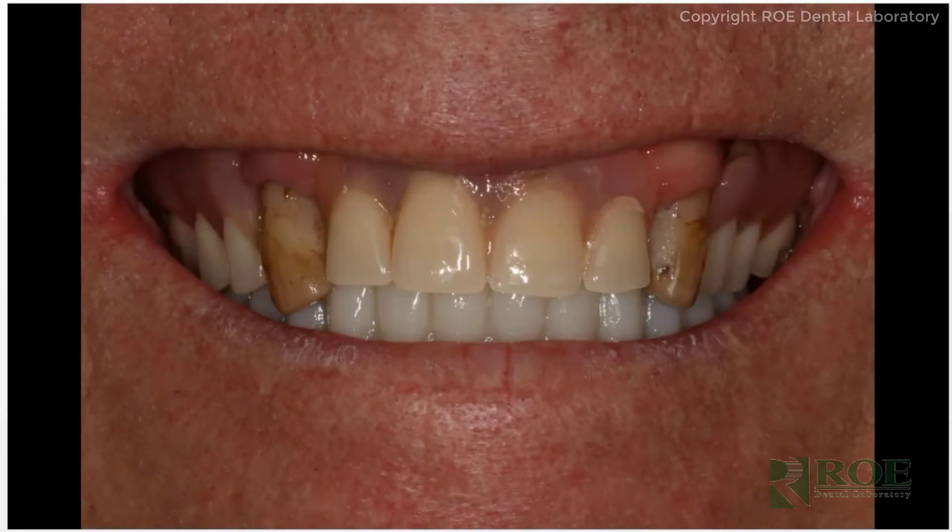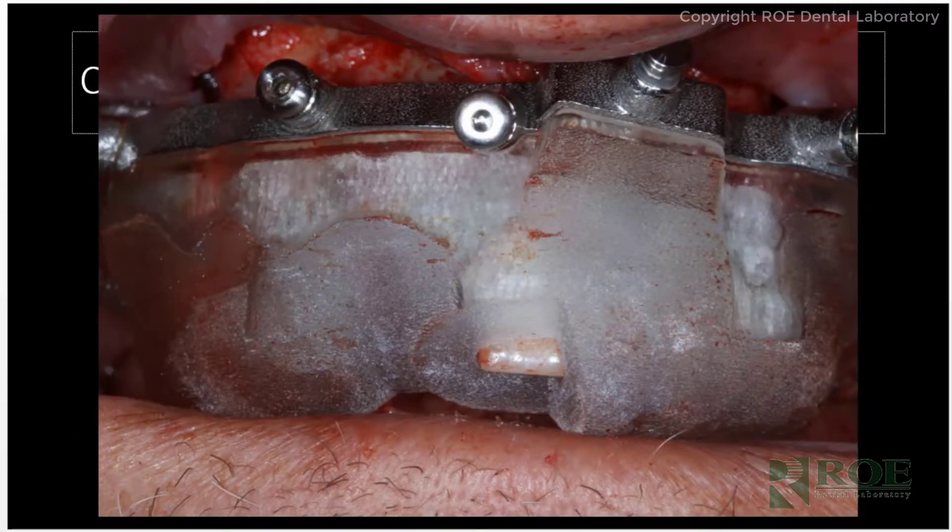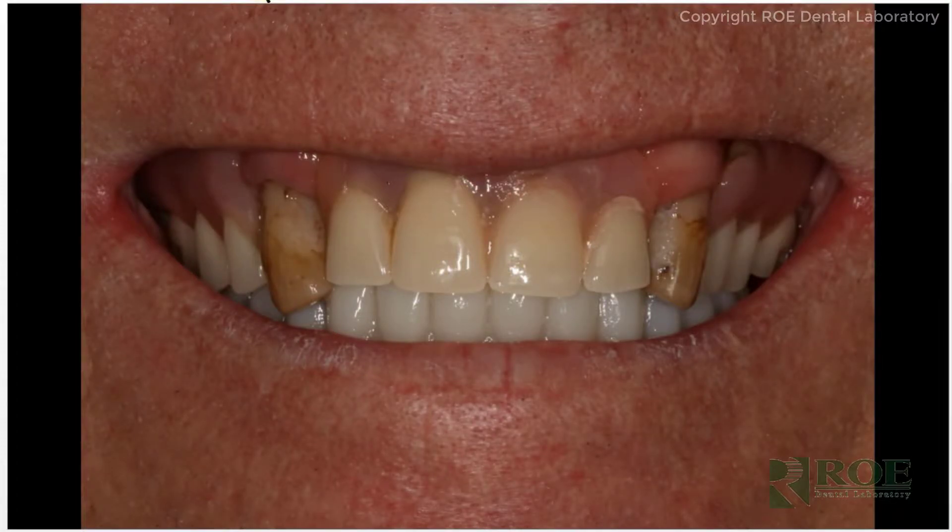In this particular case, the patient received Chrome on the mandibular first, in February 2019. A few months later, the doctor came back for the second Chrome arch on the maxilla. We designed the mandibular case to meet the existing maxillary occlusion — there were just a couple of teeth remaining and the partial. We idealized the occlusion of the lower, then adjusted the upper during surgery to make an ideal plane for the future maxillary case.